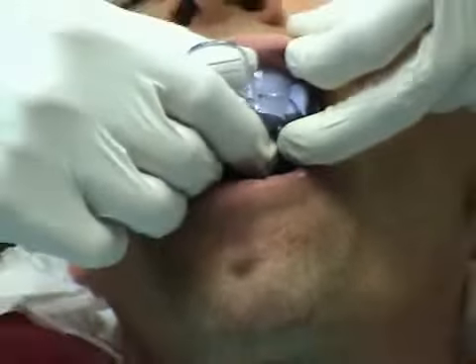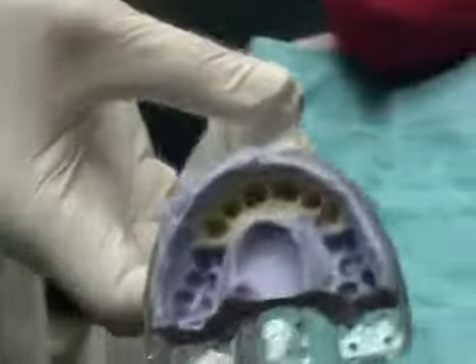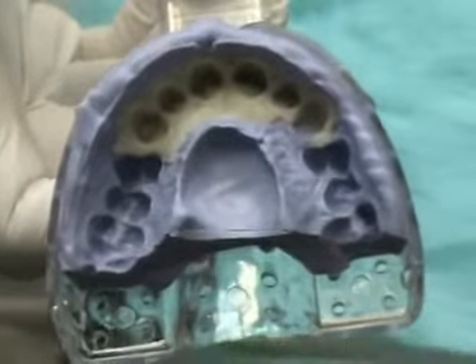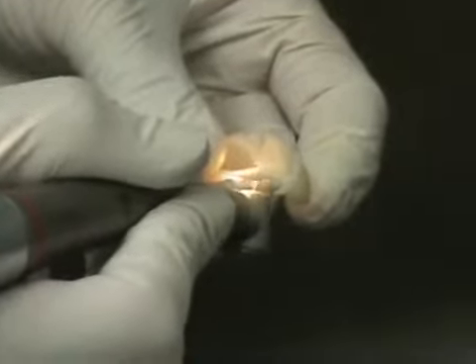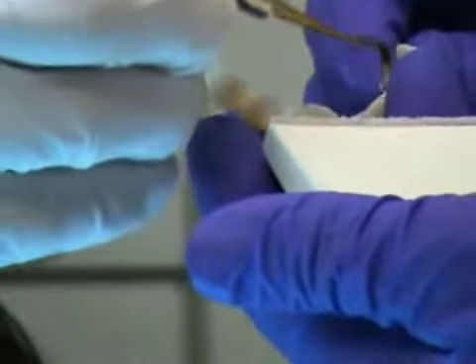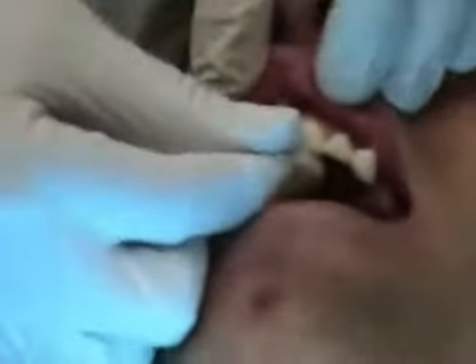The complete curing time for ProTemp Plus is 5 minutes from the onset of mixing. For optimal polishing performance, the material should remain in the matrix until completely cured. Upon removing from the matrix, excess material can be removed to refine the margins of the temporary. After the 5-minute curing period, the oxygen-inhibited layer should be completely removed from the temporary restoration using an alcohol wipe. The temporary restoration can now be cemented in place using a temporary cement.